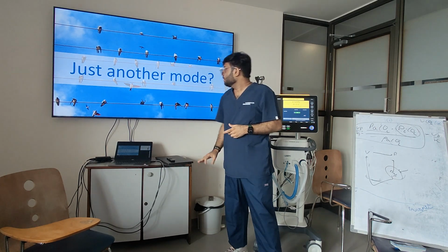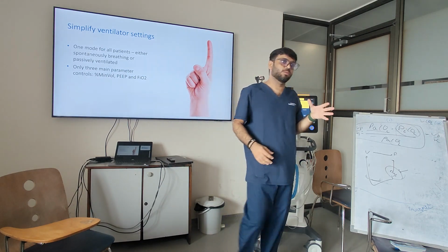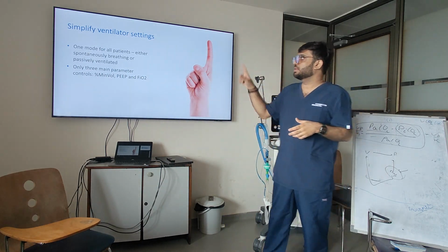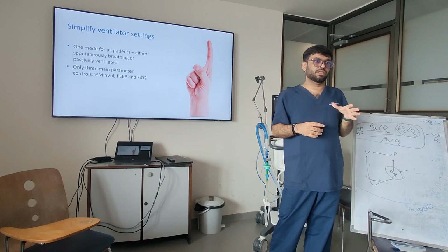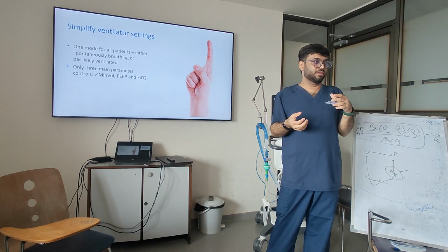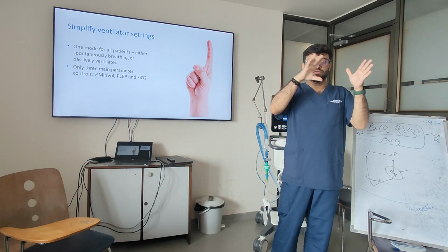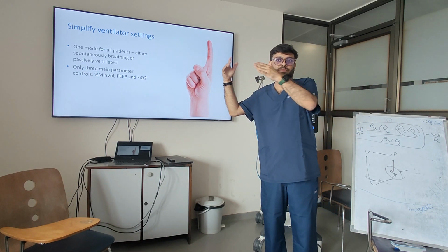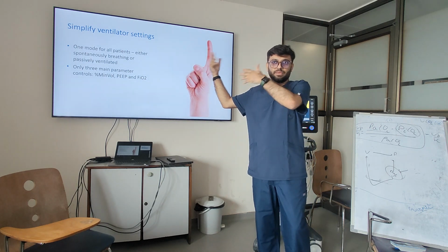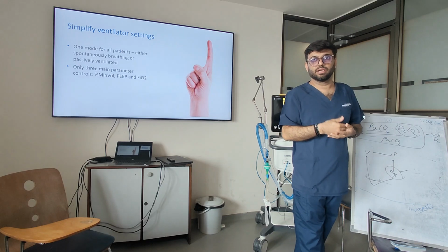Now, is it just another mode? It of course is a mode, but it has more simplified settings. So it is one mode for all the patients who are breathing spontaneously or are passively ventilated. So you don't really have to change the mode, like how we change from CMV to SIMV and PSV, and then you extubate. It is one mode. You can start the same mode when you intubate the patient, and you can continue the same mode.